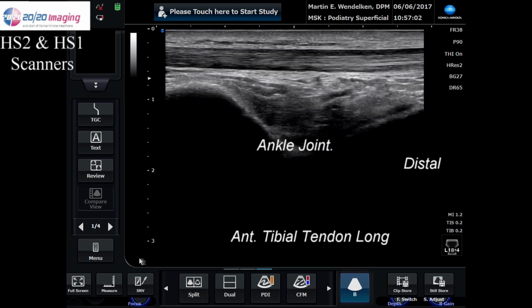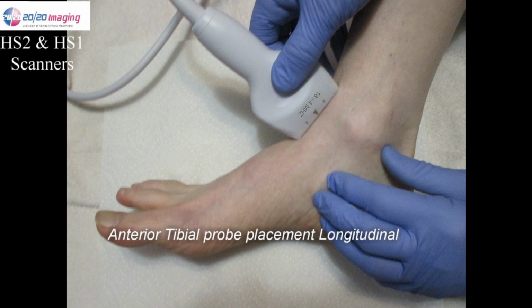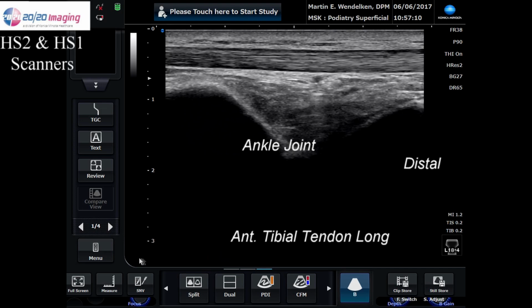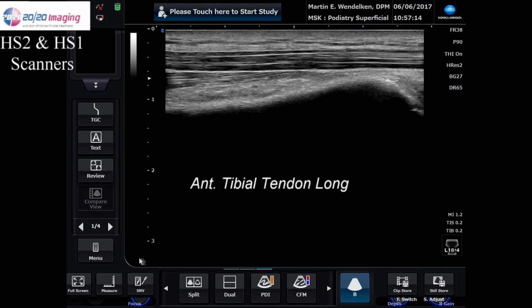Here you're demonstrating the tendon. As you can easily see, this is the probe position. And within the image you should easily see the fibrillar pattern of the tendon. Those are the fibers of the tendon.